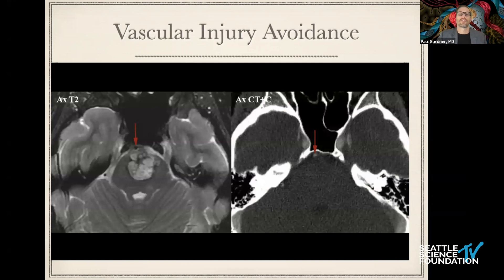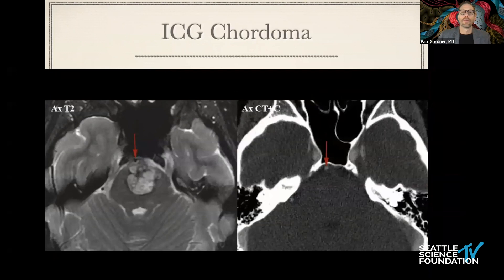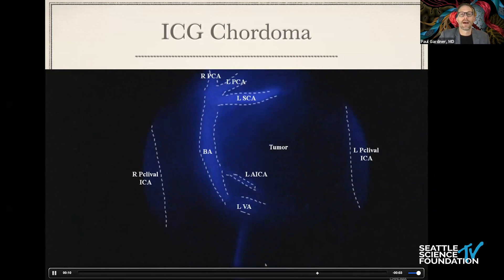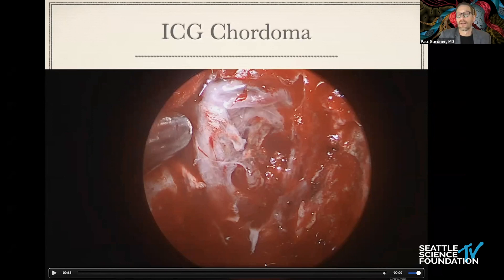There are new tools to avoid vascular injury. In cases where it's very tough to tell where the basilar itself is once we open — here's indocyanine green. We're seeing just a haze of tumor capsule, but as soon as I use an ICG endoscope, I can see very clearly where the vasculature is and where to cut. Previously I would have had to guess or use image guidance, but now I can very clearly see the vasculature.